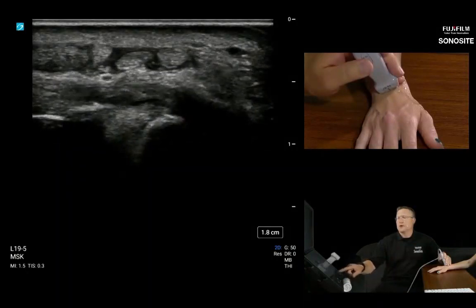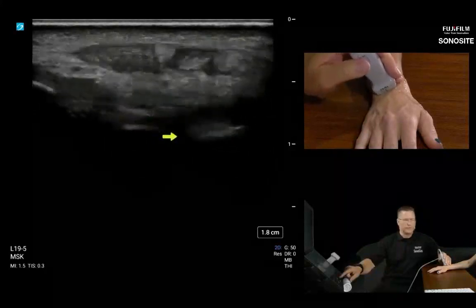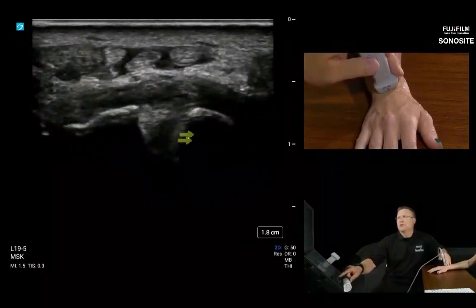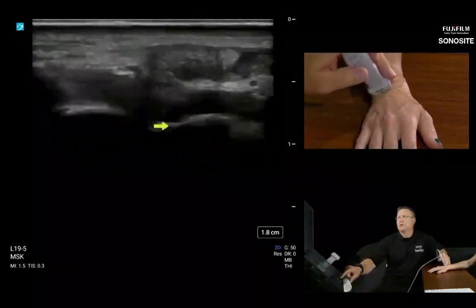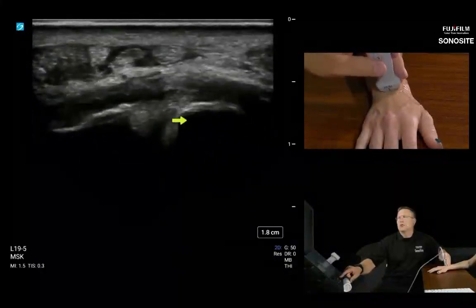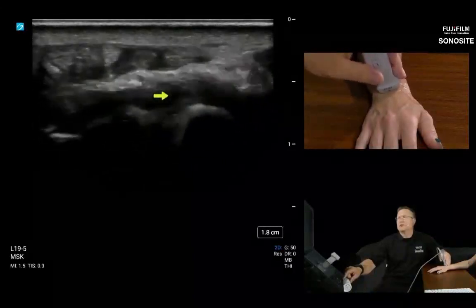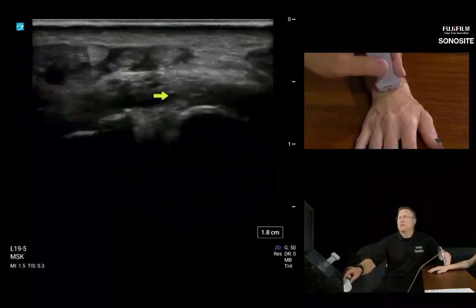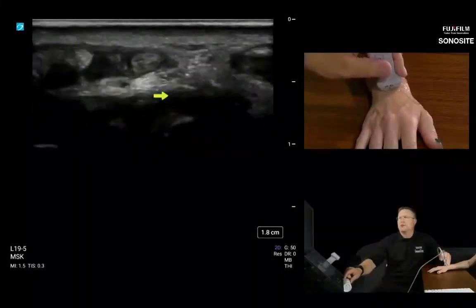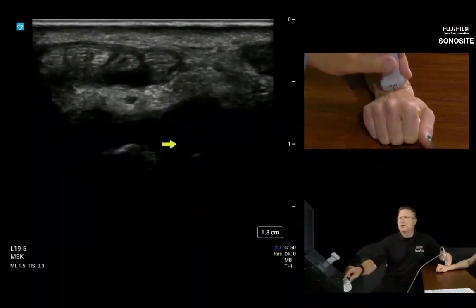A joint radially is going to be scaphoid. Nope, other way. So this is all scaphoid. Here's the joint space. And then here's lunate. Okay. So when we're just evaluating these, normally we're looking for ganglion cysts, ligament disruptions, joint effusion superficially, inflammation, synovitis. But for mechanical disruptions, it's helpful to do dynamics like squeezing the fist and then reevaluating the joint very deep.